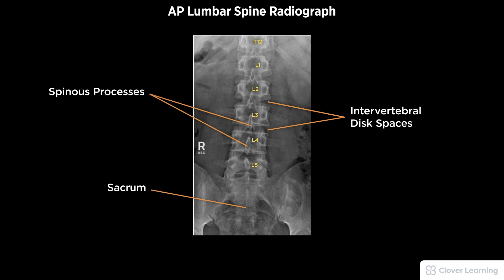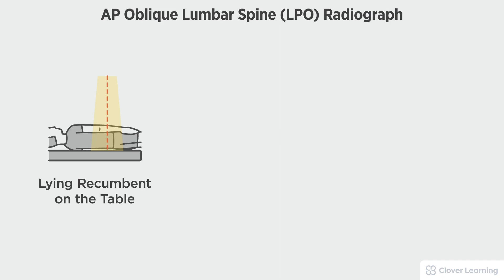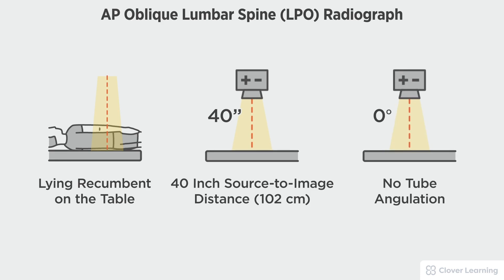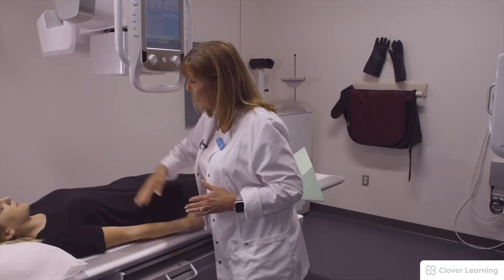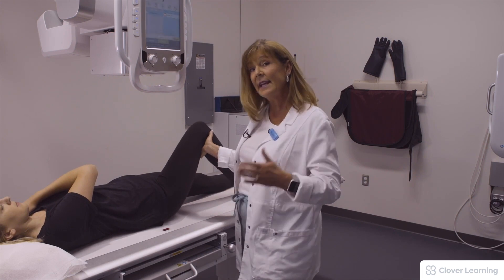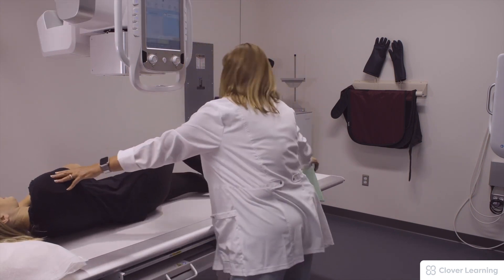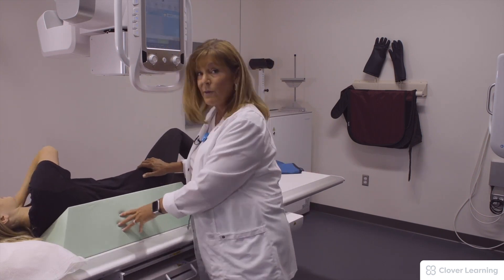In this view we will be demonstrating the AP lumbar spine left posterior oblique. The LPO view should be performed with the patient lying on the table with a 40 inch source to image distance and no tube angulation. I'm going to have the patient bend this knee and control movement by the shoulder and hip, rolling her up uniformly, and use an angle sponge to immobilize at 45 degrees.